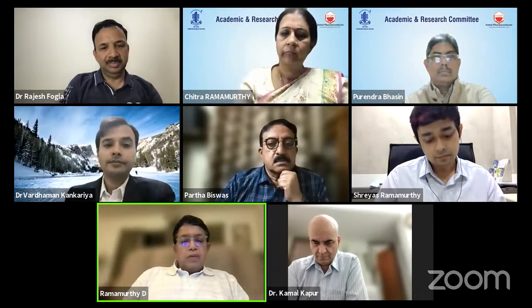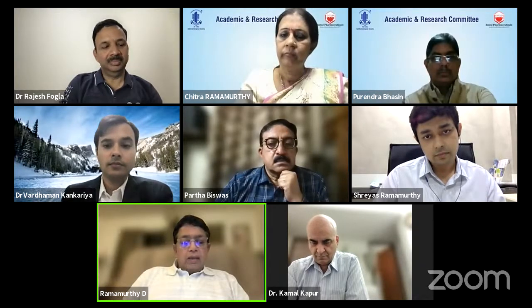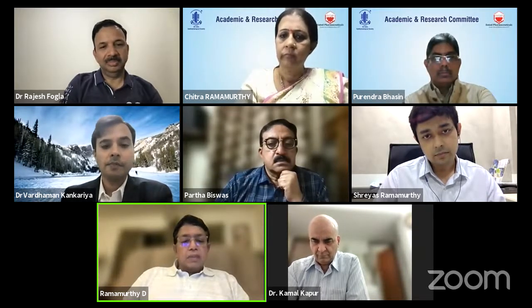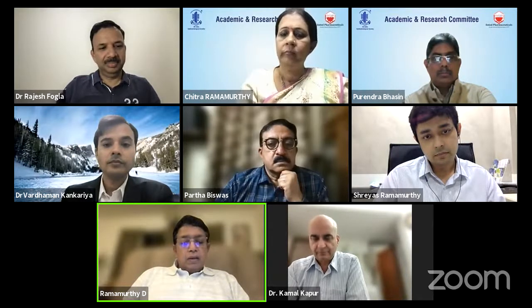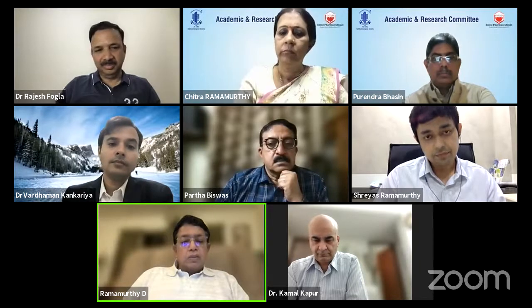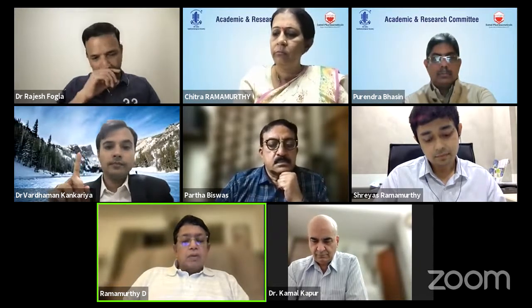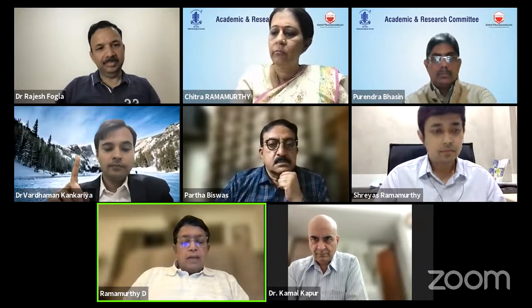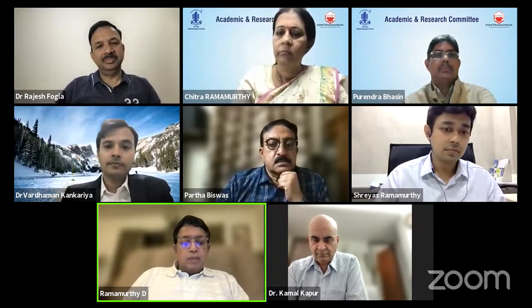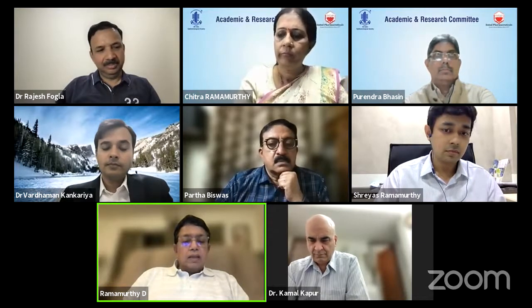If these two tally together, then go with the measurement. Obviously, we have tried UBM, but as was pointed out, it's very often difficult to even identify exactly which is the sulcus, because of the kind of clarity you get with these instruments. If you give two different observers, or the same observer, a measurement to take, you will get two different measurements. So we have practically given up using UBM for this, though because the lens rests in the sulcus, you would think that's the right way to go.